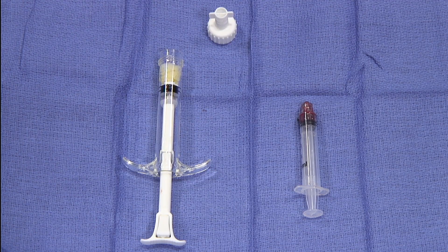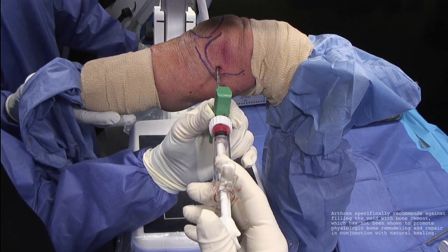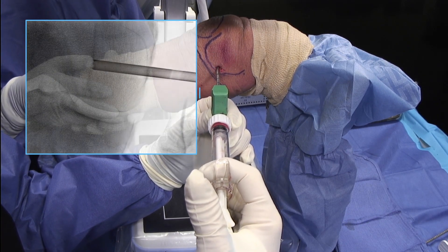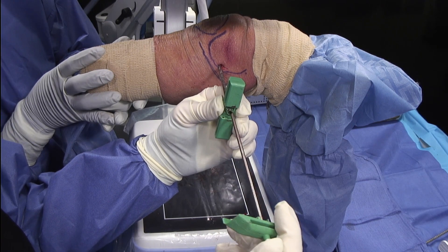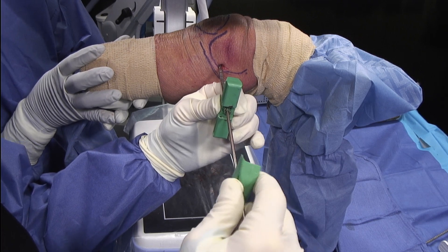Alternatively, to take advantage of the osteoinductive properties of DBM, the bone marrow concentrate can be mixed with DBM and then injected into the previously decompressed lesion. After one minute of mixing, we are ready to transfer the mixture into the core decompression site. We then inject through the delivery system. I like to back out as I'm injecting to ensure complete fill of the core decompression site. I use the inner stylus of the delivery needle to deliver the last one cc of product into the core decompression site.